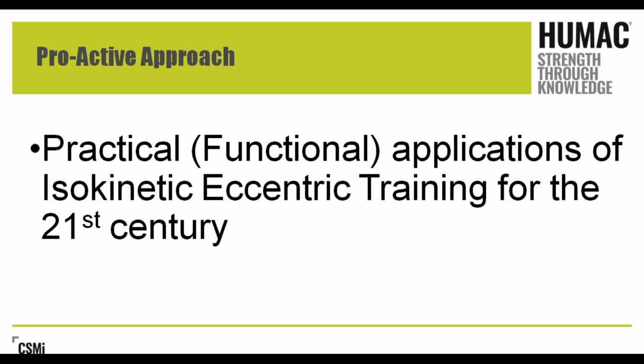And we take some of our patients fairly aggressively through this. So it really depends. I'm not going to venture that I want you to take anyone into 200, 220, 240 deceleration training without training them all the way through each one of these aspects, because it's not good to put somebody under high levels of force if they haven't been trained for it. It's just like taking someone who's never been trained and telling them to jump off a 5-foot ledge. They haven't adapted to that type of force and deceleration. But as we keep training them, we know that we're going to get to that point.